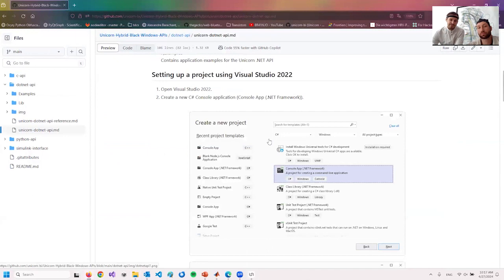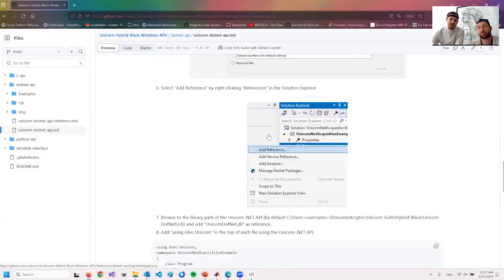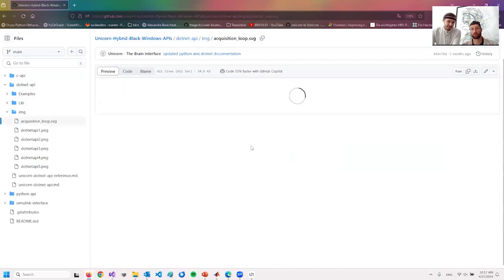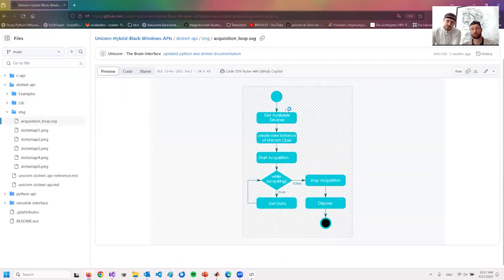There's an introduction on how you set up your project and what this acquisition example usually looks like. For a BCI system, we are continuously getting data with a fixed sampling rate; the Unicorn sends you 250 samples per second. Therefore, we need something we call an acquisition loop. We connect to our device, then start data acquisition, and then acquire data in a loop for the amount of time we want to receive data.